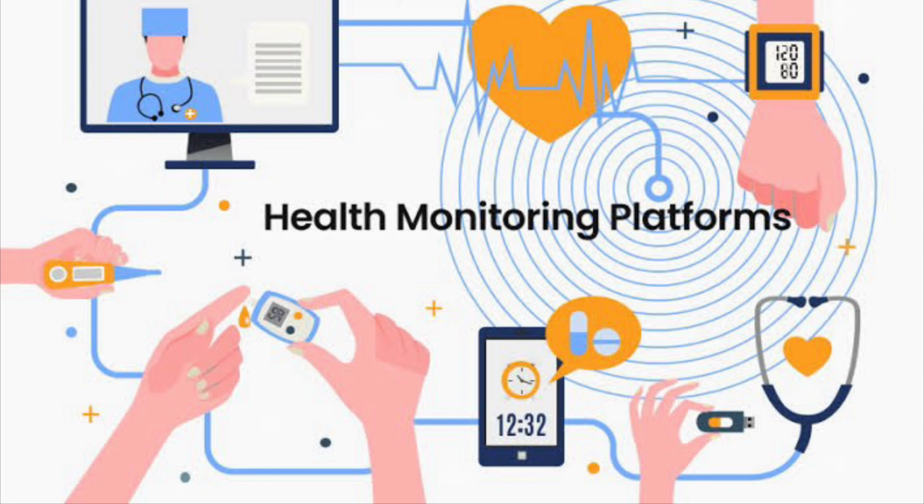One has to decide whether you want to buy this or lease this. The advantage of leasing is definitely if new technology comes, you can go to the next technology so that whatever you have with you can be replaced by the new technology devices. But naturally, leasing becomes more expensive when you compare with buying. The problem with buying is naturally when you buy a device, next year it's going to be obsolete for sure.